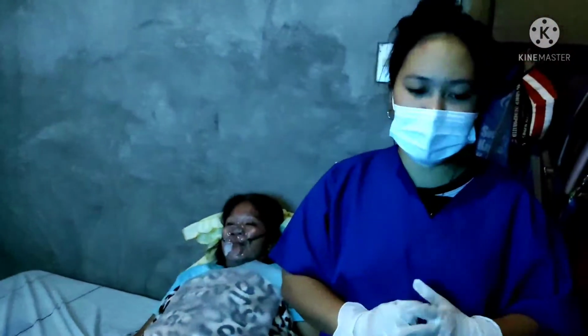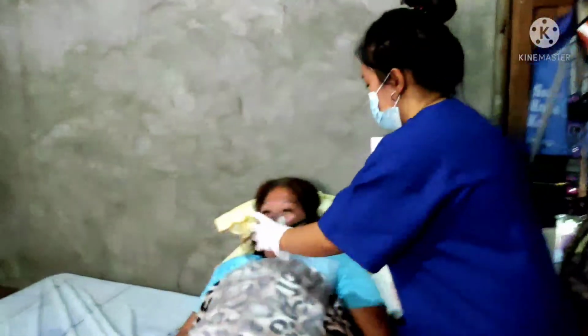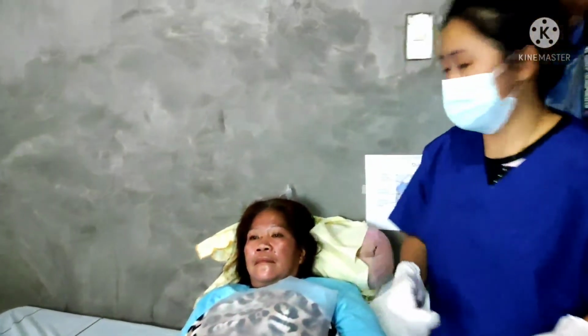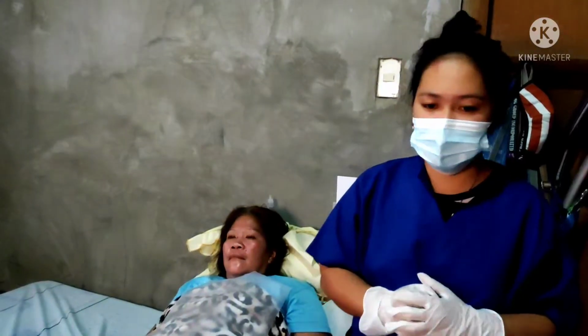Use your non-dominant hand to remove the oxygen delivery device. Ask the patient to inhale deeply.